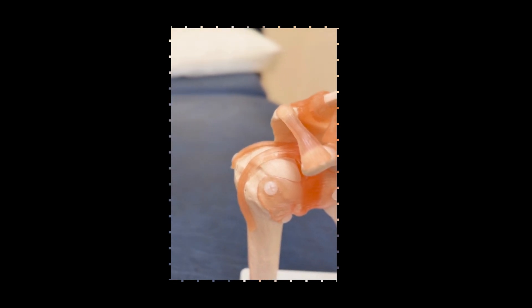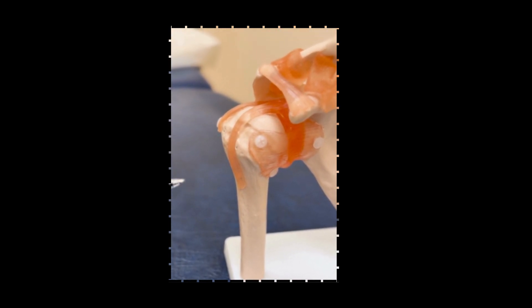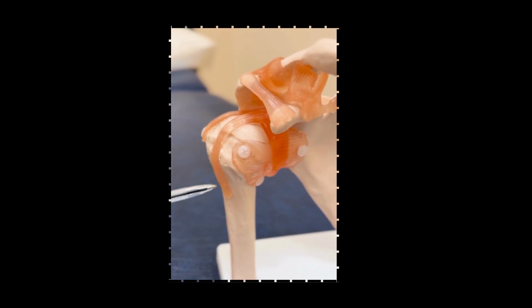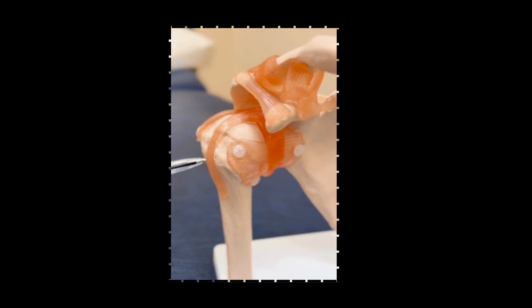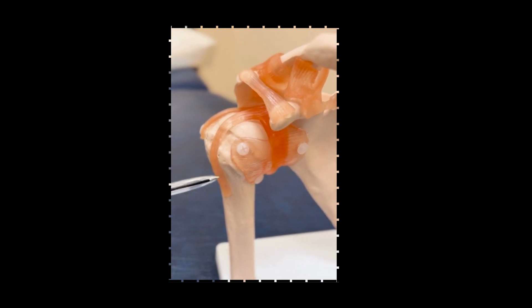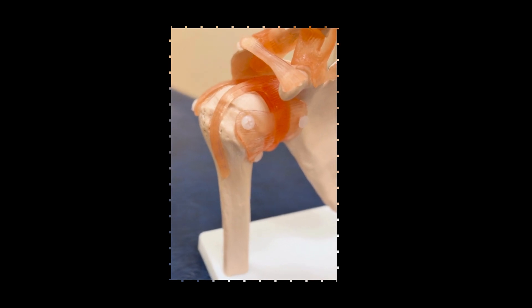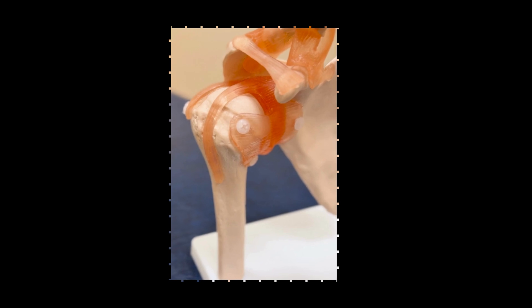You can see, if we turn the model slightly, why Dave will talk you through how to actually angle your probe, because of the angulation of the long head of biceps as it comes down onto the humeral shaft. It doesn't just move straight down — it actually drops in slightly back on itself and onto the bone, and that's why there are challenges around probe angulation and anatomy to ensure that we get that tendon nice and bright and avoid artifacts such as anisotropy.